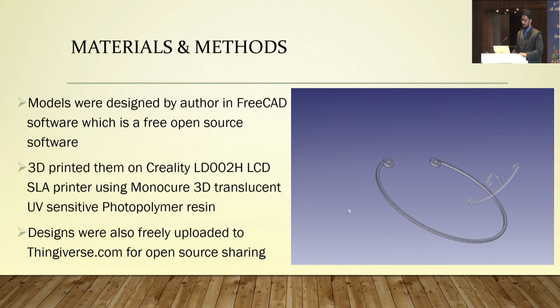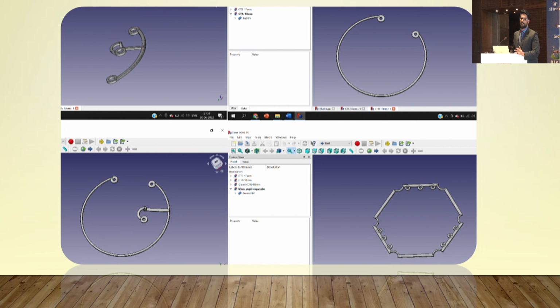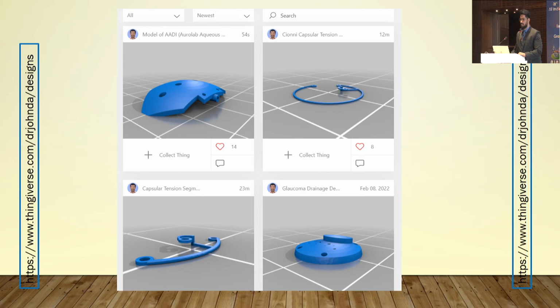So this is the resin-based model, and the 3D printing lab available at our dental facility is already used for printing many photopolymers for prosthodontics. So we put them into the 3D printing machine, and it takes about 12 to 14 hours to print many of these, and then they are dried and cut into the various shapes that are required to actually put them in. If you look at the various devices that we had printed, they are usually geometrical or symmetrical in shape, because the closest that we could get were symmetrical structures on the free software. The paid software, however, can allow you more complex designs. So that could be a limitation of using free software. And then that is uploaded to Thingiverse, which is, again, an open source platform.